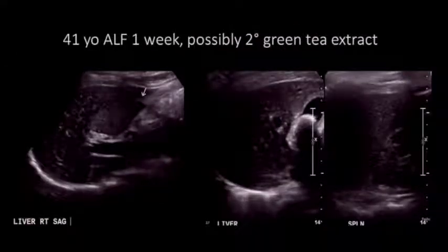Turning now to a patient with acute liver failure, now out about a week. It was thought that this patient had her liver failure due to having taken some green tea extract from an herbal source. This liver is a bit different. This one is beginning to look somewhat abnormal. Most of the liver, if you look here, is relatively hypoechoic, and the portal triads stand out a bit.